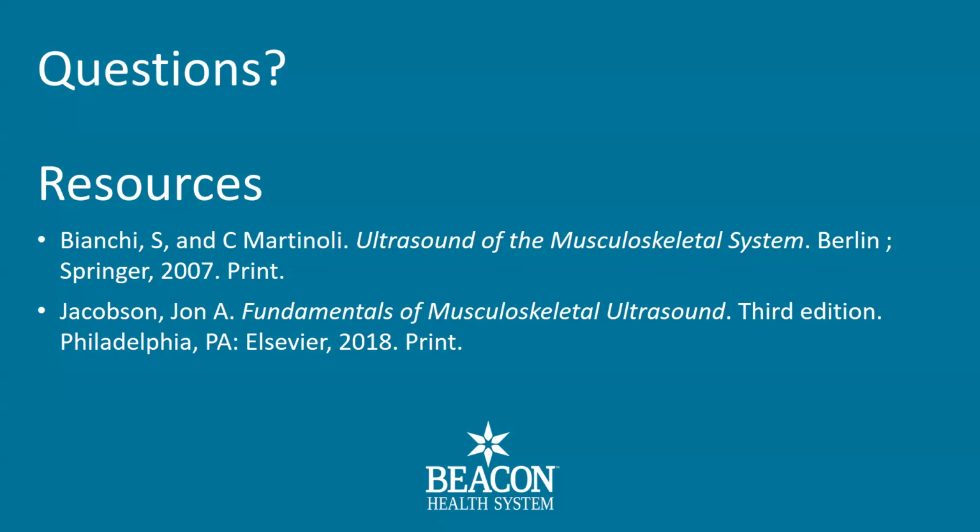For these Pes Anserine cases, I receive a decent amount of referrals for ultrasound evaluation of this and potential interventions. I'd say in the majority of cases, I don't always see a ton of bursal distension for a lot of patients. I will say the two subsets of patients and pathology where I have truly seen bursal distension have been, as shown in your case, patients that have had hardware at that area, especially if they've had an ORIF where they have some type of mechanical irritation as you demonstrated.